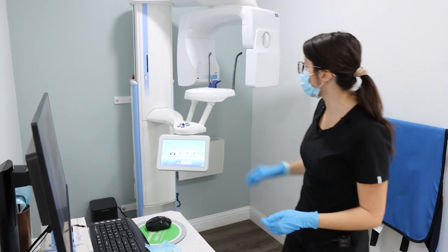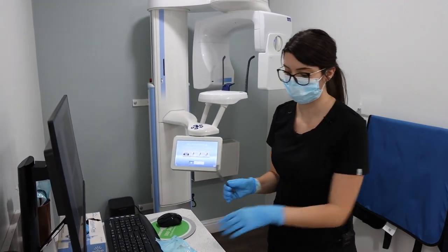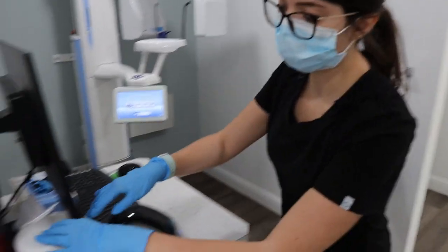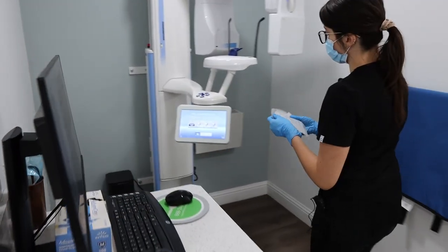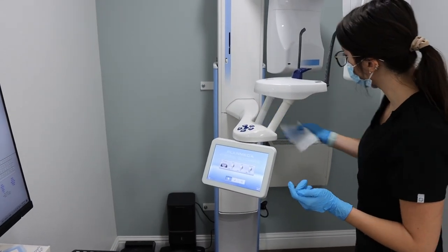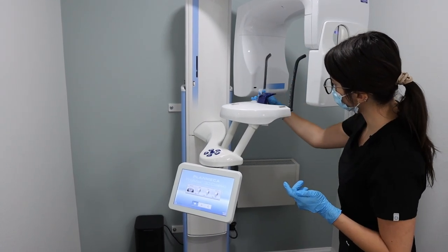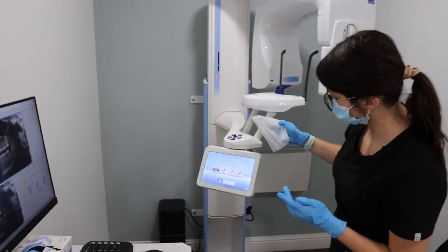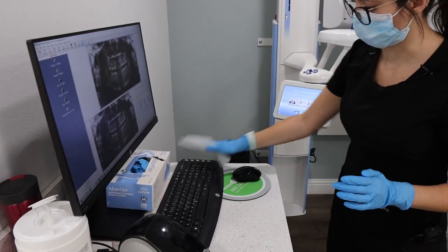At this point you're going to clean up. You're going to remove the pano stick and take it to sterilization. You're now going to clean off the panoramic machine. You're going to take a caviwipe and wipe the handles, wipe the chin rest, wipe the bars that rest on the patient's temple. You're also going to wipe the buttons, the screen, and the mouse and keyboard.